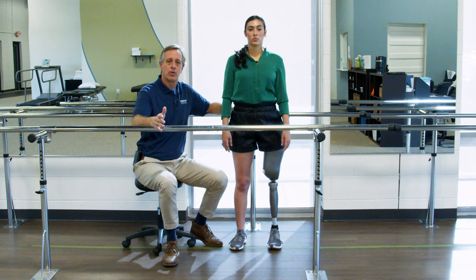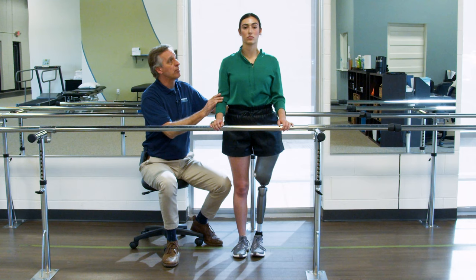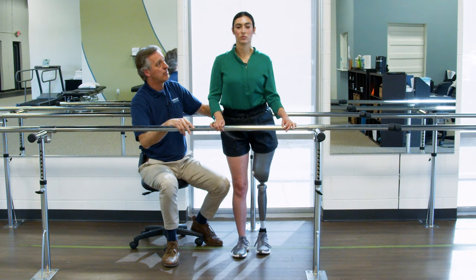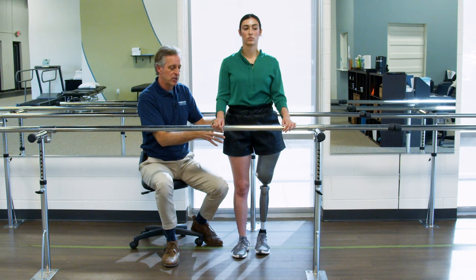And you're thinking, okay, if I know it's easier to move away from the prosthetic, then I always want to bias my positioning when I'm playing a game or a sport. Like if I'm in softball and I'm playing in the outfield, I want to step towards the prosthetic side, knowing I can move away from the prosthetic much quicker. If I'm playing basketball and I'm guarding somebody, I'm going to line up on their body halfway over towards the prosthetic side. So there's not so much time for me to get left as it's much easier for me to get right. So that process picks up and just get that sense. And just in reality, realizing it's easier for me to go one way than the other.